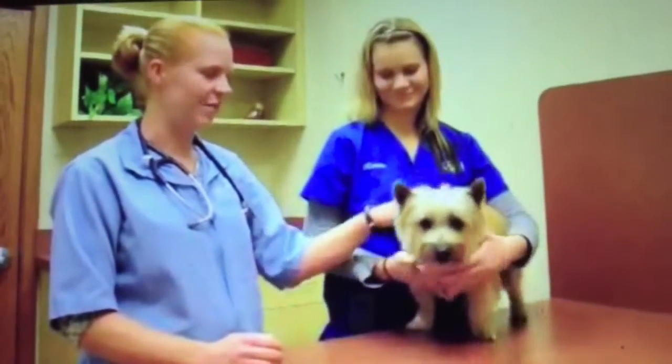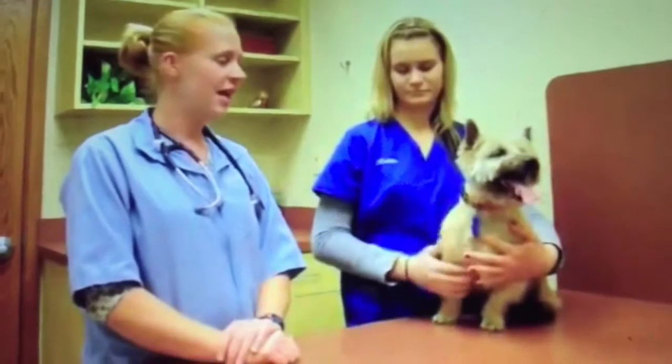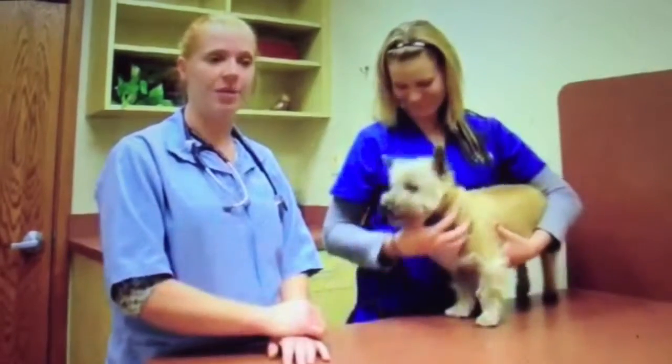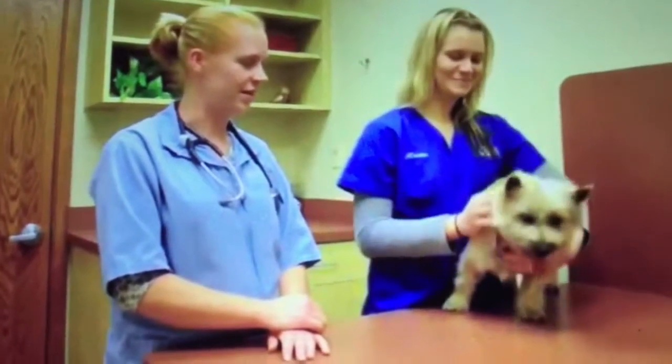Sometimes they get a little scab right where it's placed, since it's placed with a little bit bigger needle than a vaccine is. But then anytime, you can identify your dog by just a simple scan, and a number pops up and a phone number that helps to identify the pet.